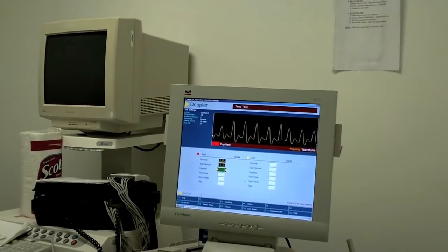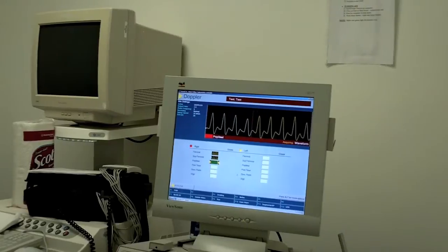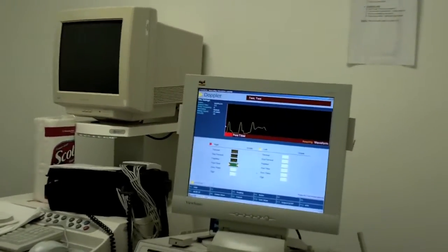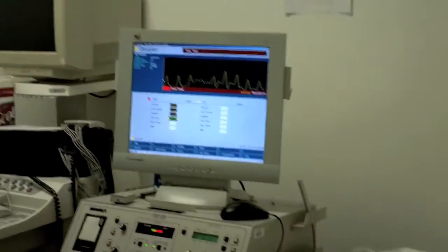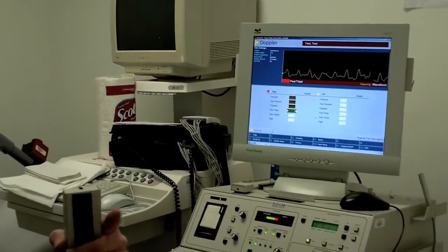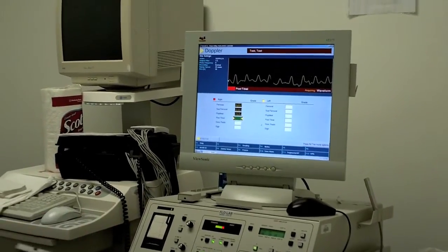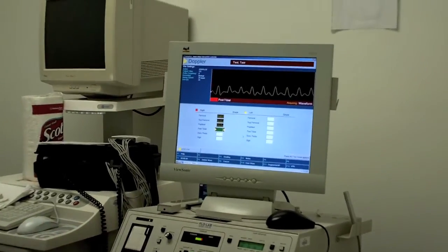Again, I didn't change size, just my window. Freeze, save. You hear a little bit of venous coming in there too, but I got it before the veins started to interfere. If you get venous interference, it's going to cancel out your arterial signal, because one vessel is flowing towards the probe, one's flowing away, and the two working together is not going to give you a good signal because they're going to be canceling each other out.